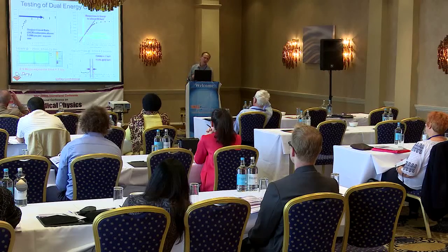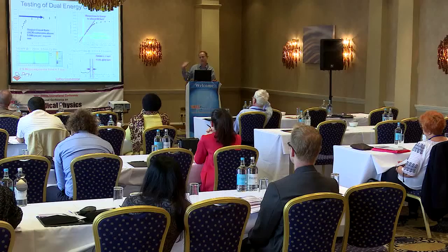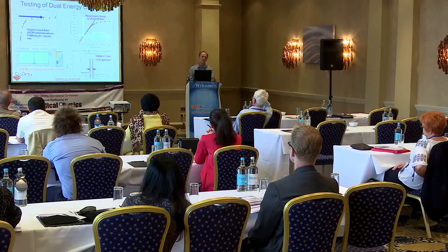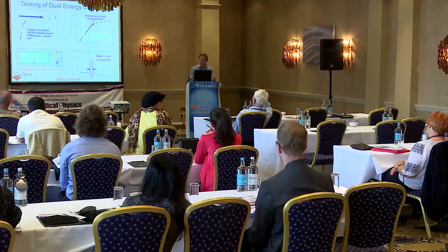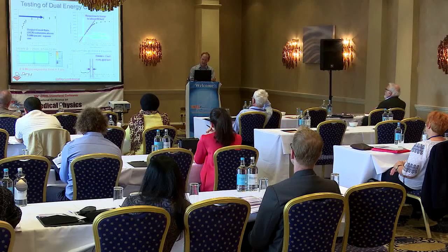And so here we can take a look at the output count rate ranges and the energy resolution that was achieved in this first dual energy CT technology. And we were able to achieve an output count rate above 5 million counts per second per square millimeter, and with a dynamic energy response up to 140 keV, and with an energy resolution of about 6 keV full width half max.